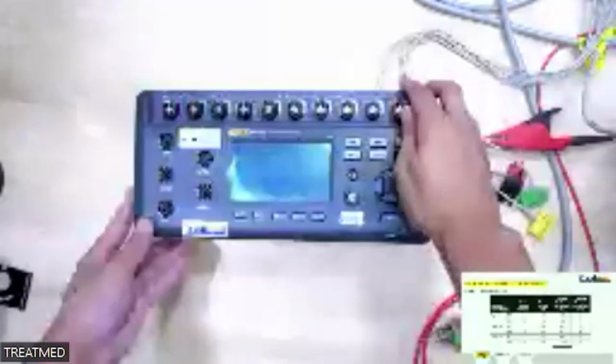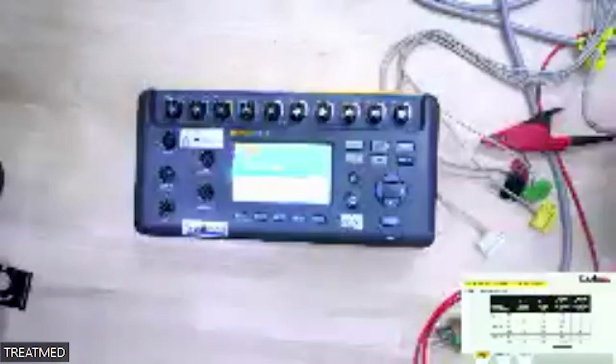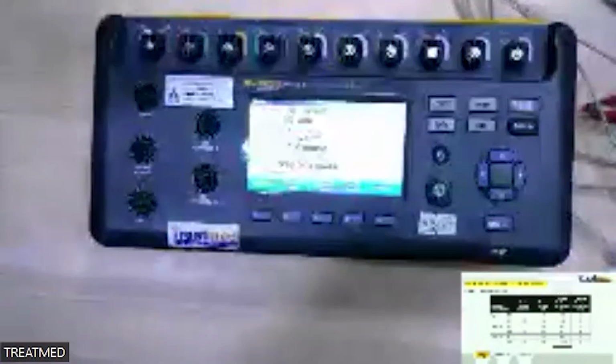Next, this is the patient simulator for doing the performance testing for the vital sign monitor and NIBP, ECG recorder, and oxygen saturation. Okay, I will show you the display in the patient simulator.